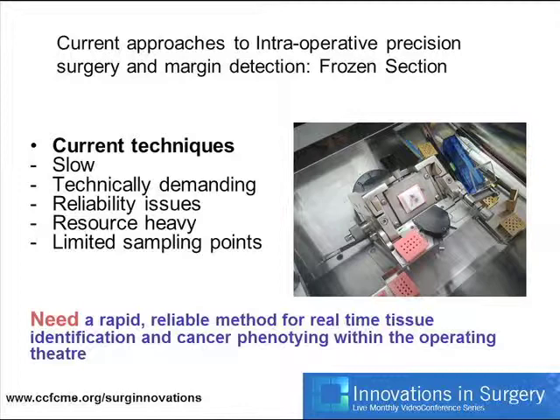At the moment, though, we have few tools to really help us do that. Frozen section would be a standard approach, but it's not really scalable. It's quite costly, it's quite slow, it increases operating time, and it's resource heavy. You need someone to look at the tissue slide.